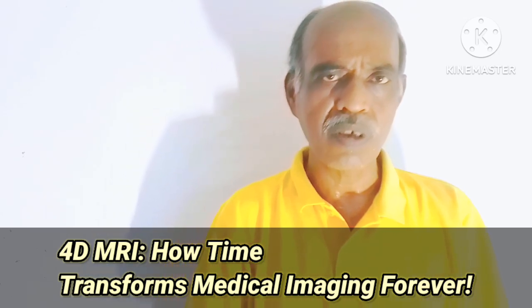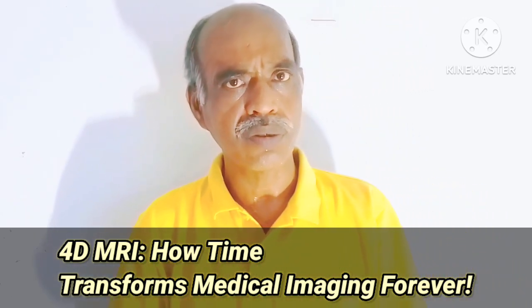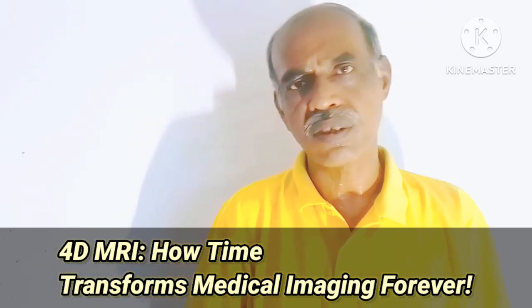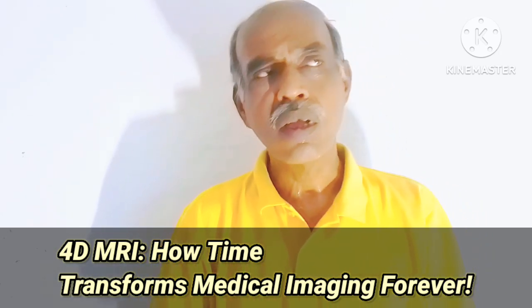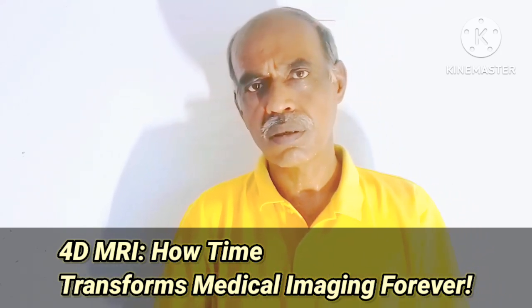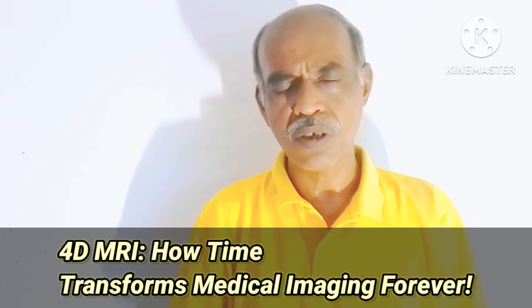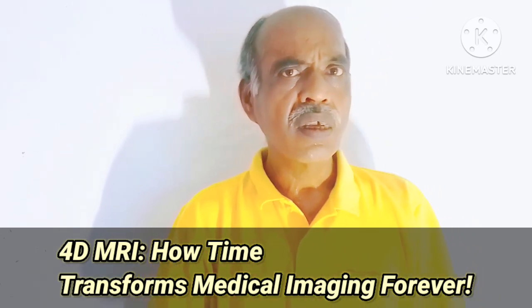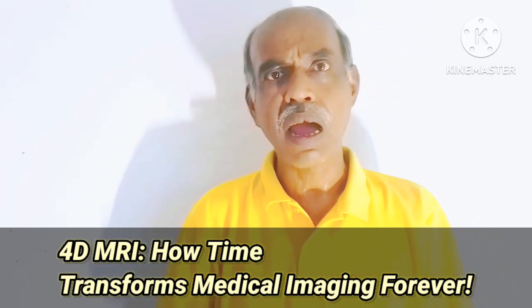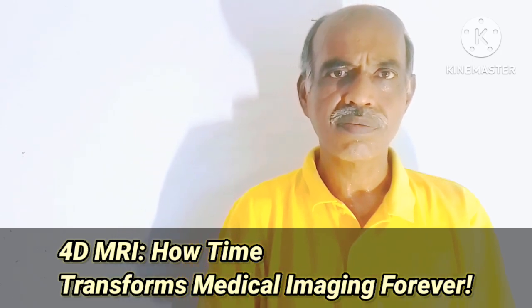Inside the body of the patient, water is there, and water contains hydrogen atoms. Throughout the body, hydrogen atoms are available in any human body. Since a strong magnetic field is present, the hydrogen nuclei are aligned.